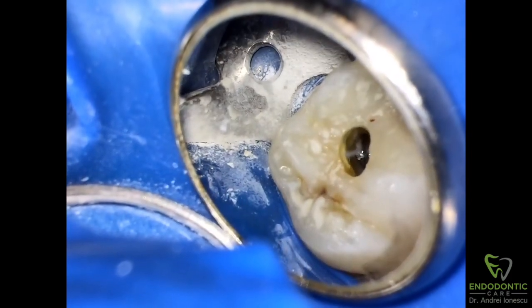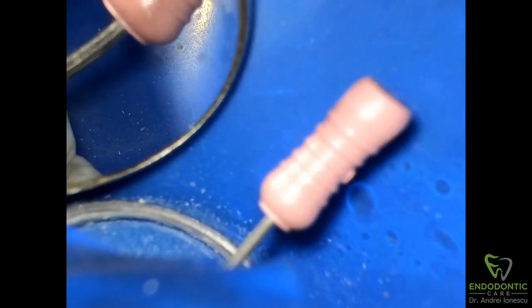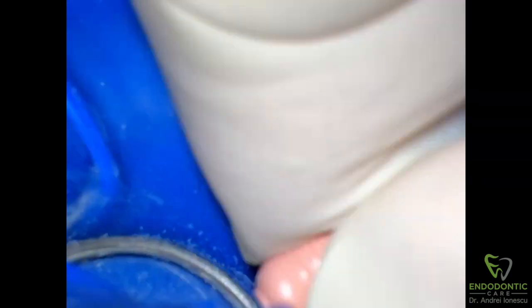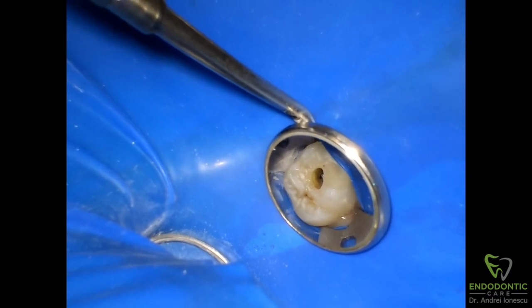So there it is — you can see the instrument, you can see the top of it. The first thing I tried to do here was see if I can work my way down beside the file with a very small instrument. This takes time but I feel like it loosened the file a little bit more and maybe helped get it out a little bit easier. You can see I created a little path right beside the file.